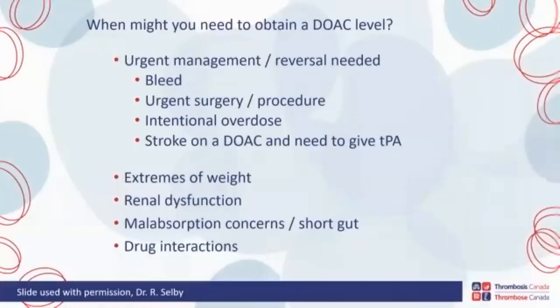All right, so in Hamilton, we've actually moved to 24-hour rivaroxaban and apixaban assays at our trauma cardiac site in order to ensure that we can offer those drug-specific anti-10As in a timely fashion so that we're not holding up lytic therapy.